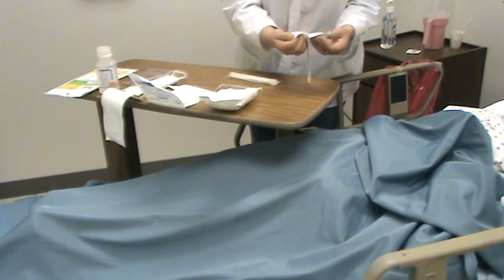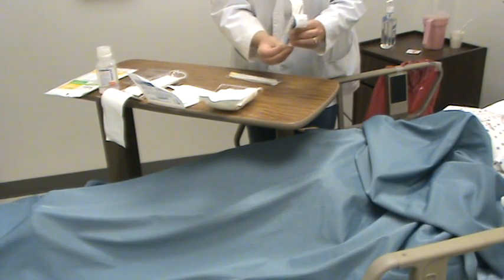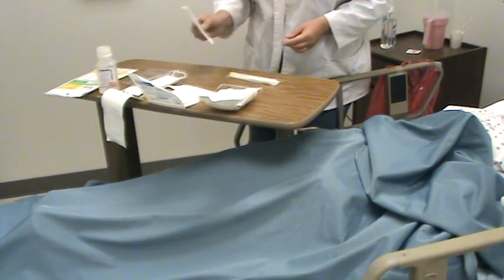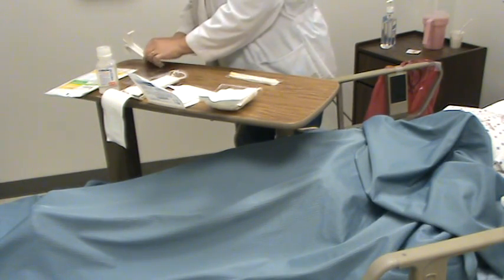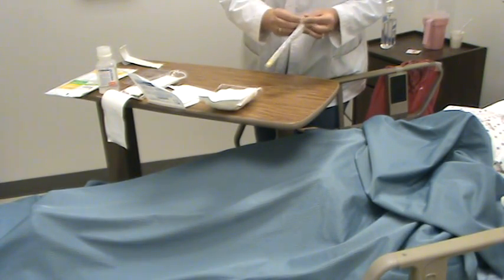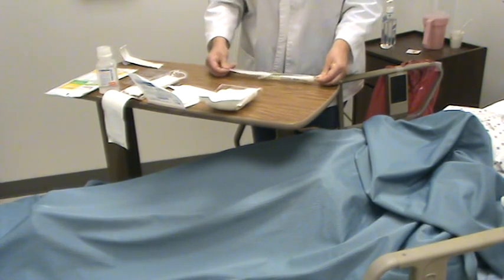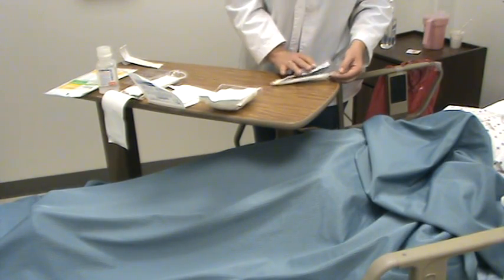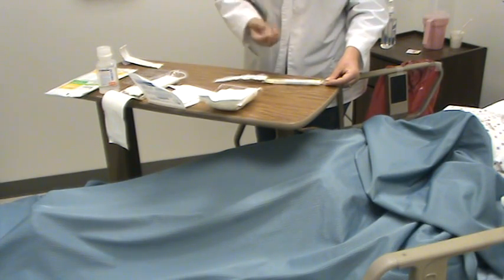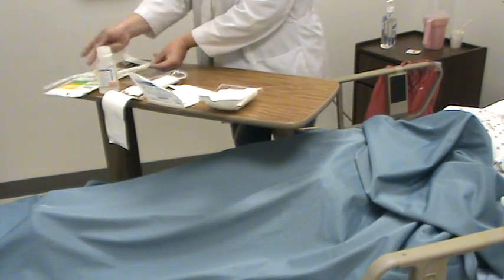I usually just open them up and what I like to do is loosen them up and try to get one of them just a little bit higher than the other one, so it's easier when I want one to just take one. I'm going to put them on the side because they're still over the sterile portion, so they still have a sterile feel. I'll get my culturette ready. Any time your supplies have the plastic bucket underneath, put that downward because then your things won't roll.